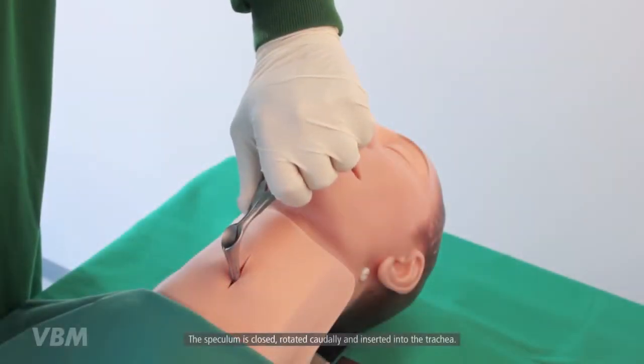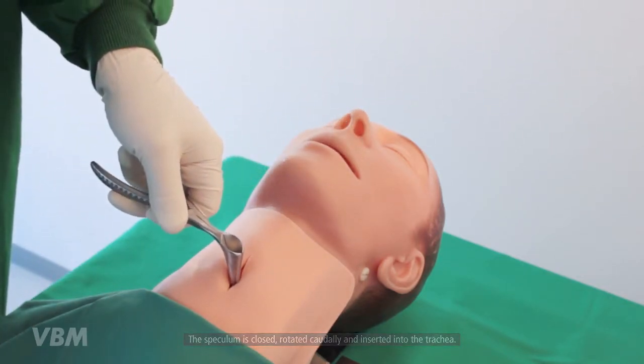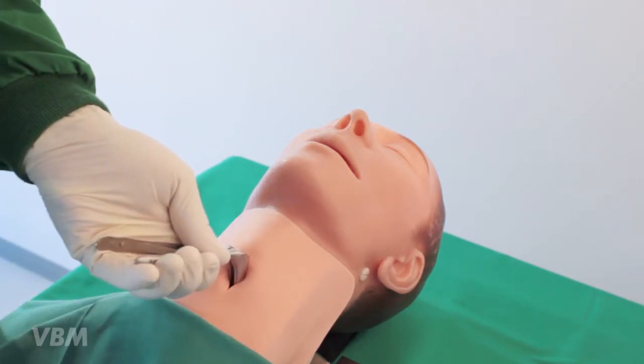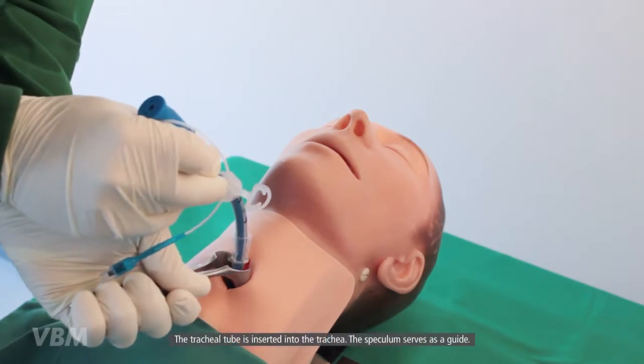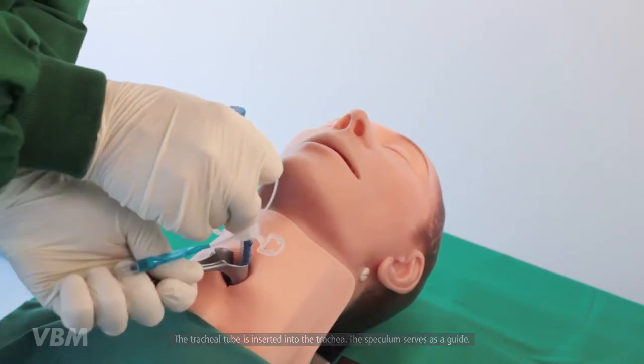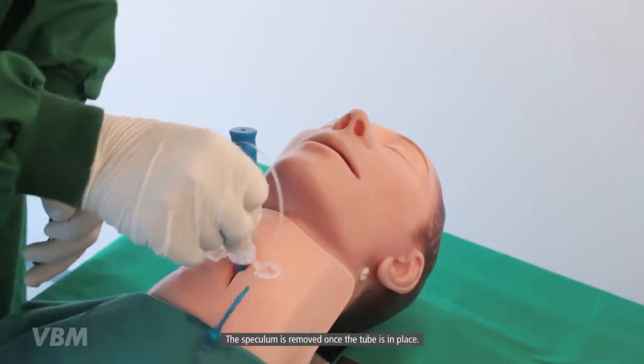The speculum is closed, rotated caudally, and inserted into the trachea. The tracheal tube is inserted into the trachea. The speculum serves as a guide. The speculum is removed once the tube is in place.